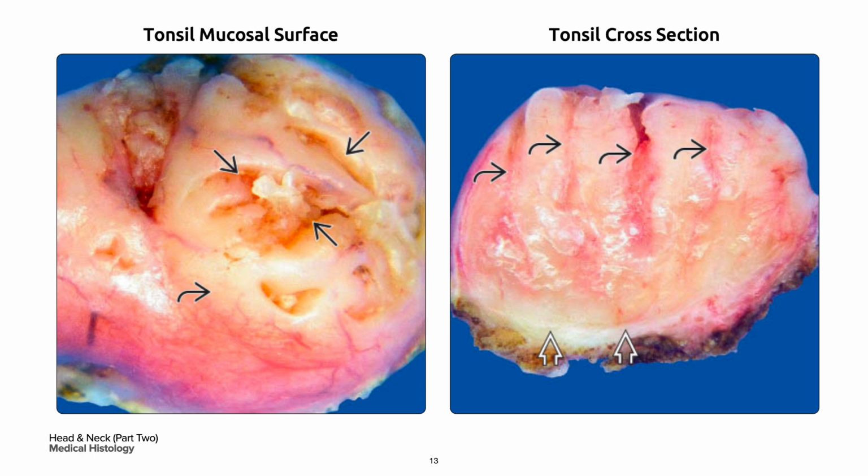On your left is the mucosal surface of the palatine tonsil, which is mainly smooth, in the curved black arrow, with 15 to 20 surface invaginations, in the single black arrow. Tonsils are largest in childhood and gradually atrophy by adulthood. On your right is the cut surface, which shows the surface invaginations, corresponding to crypts in the curved black arrow, that extend deeply into the lymphoid stroma close to the underlying compressed connective tissue pseudocapsule, in the bold white arrow.